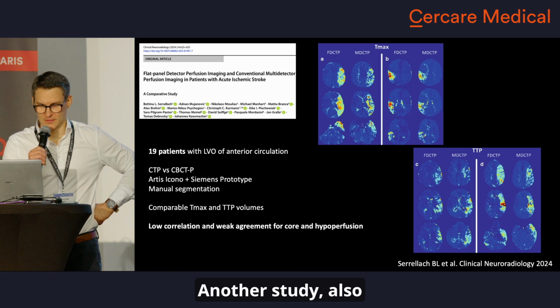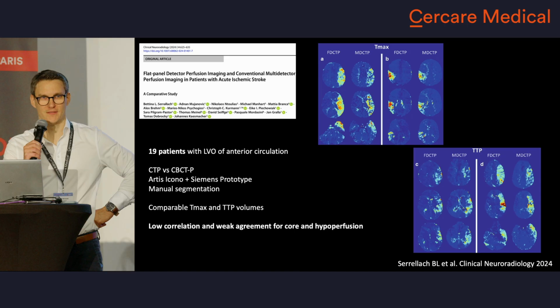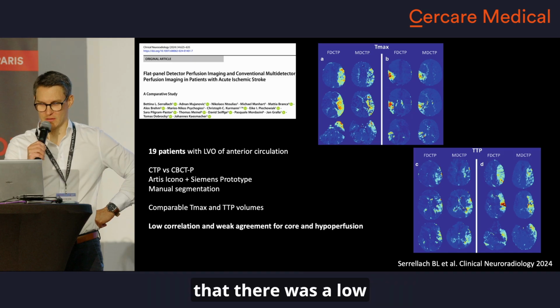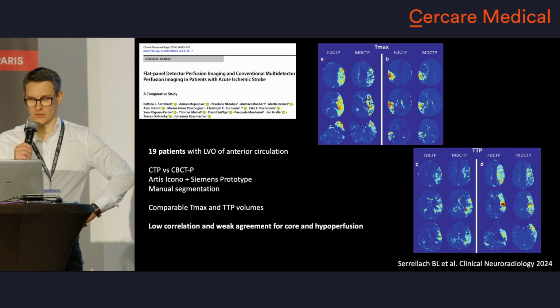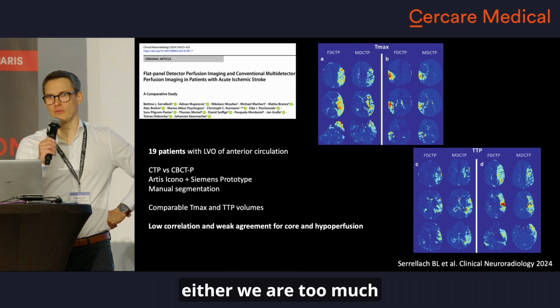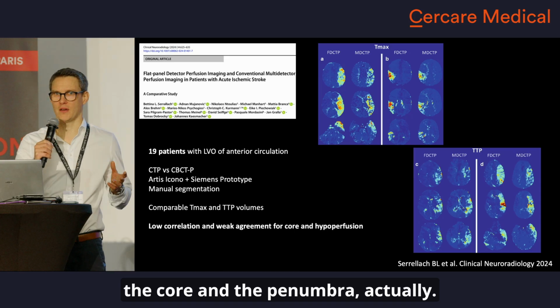Another study, also interesting, also from Bern, and this time with Artis. They also showed a low correlation, weak agreement for core and hypoperfusion, which means probably either we have too low a temporal resolution, or we have the wrong means to assess the core and the penumbra, actually.